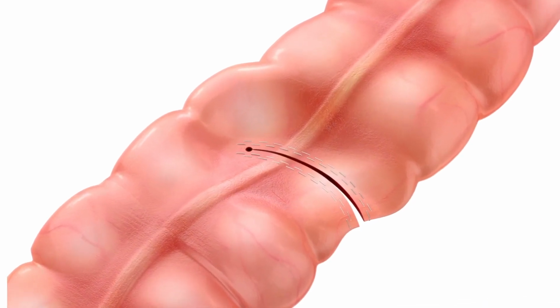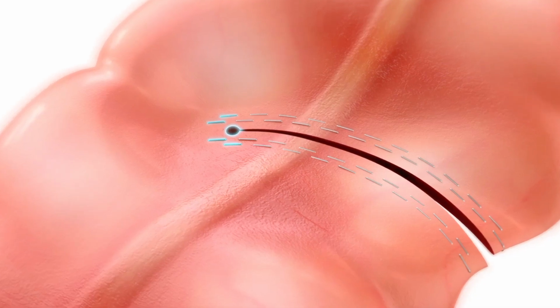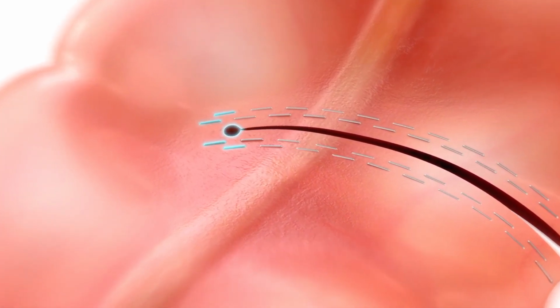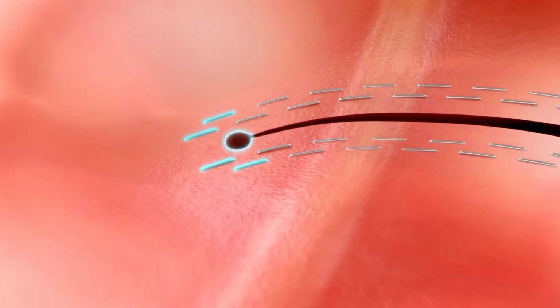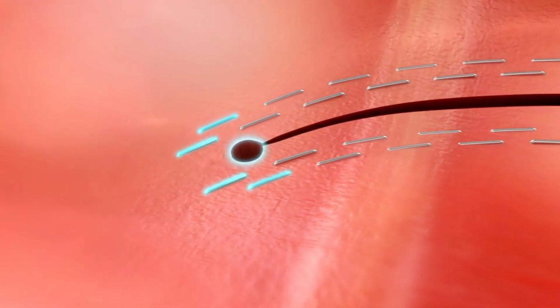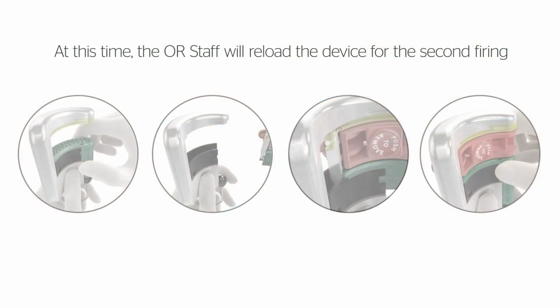Following the first firing, the tissue is transected up to the retaining pin and the staple line extends beyond the pin. The staple line extension temporarily seals against the potential of lumen content until the transection can be completed with a second firing. At this time, the OR staff will reload the device for the second firing.